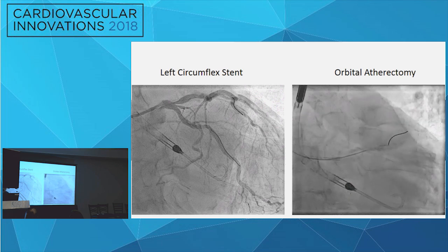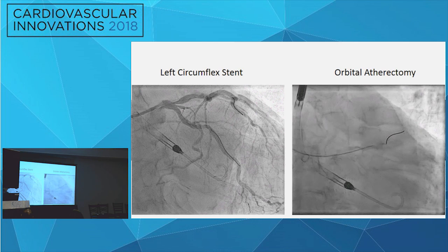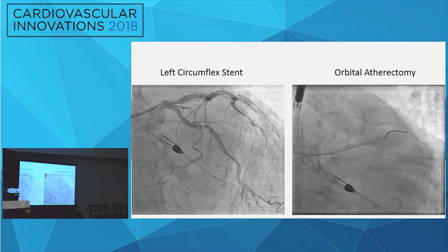But that all went pretty well. I was actually very happy I had the Impella, though, because on about my third pass of CSI, he lost all pulsatility on the Impella waveform and on our pressure waveform. I honestly don't exactly know why. I looked through everything. There was no dissection. We had good flow, but it came back after about 3 minutes.